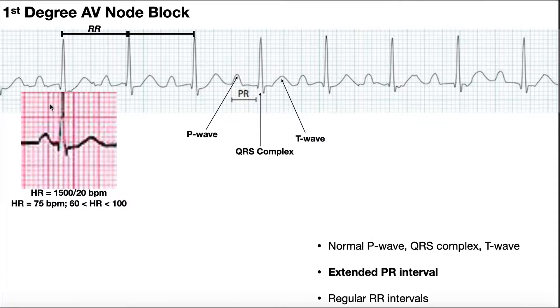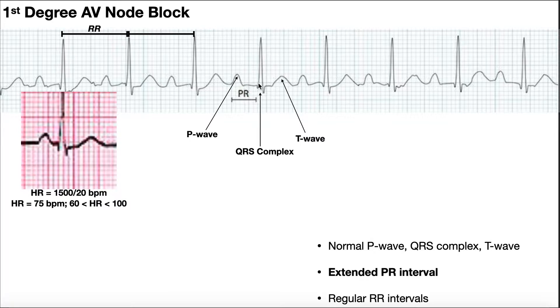Here's a QRS complex that could be from normal sinus rhythm, a T wave on the right, and a QRS complex that's narrow and normal. Here's a P wave. The PR interval is the space between where the P wave starts to rise up and where the QRS complex starts to rise up. Now look at this PR interval compared to this one — it's actually elongated here. Everything looks relatively normal: normal P wave, normal QRS, normal T wave — but the PR interval is elongated, or extended.